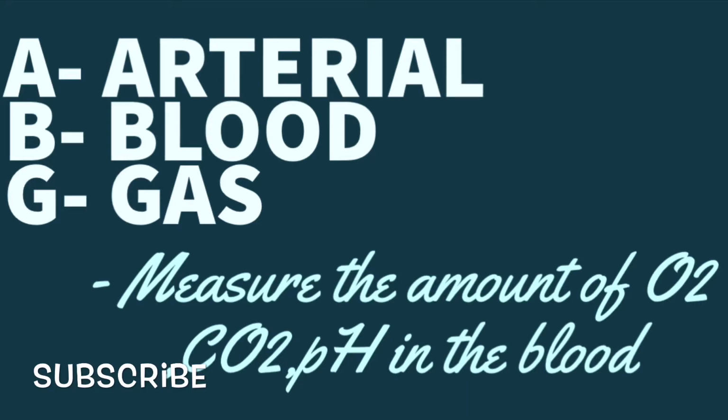So let's start. What is ABG? Which is the Arterial Blood Gas test. An arterial blood gas test measures the amount of arterial gases such as oxygen and carbon dioxide in your blood as well as the pH in our blood.